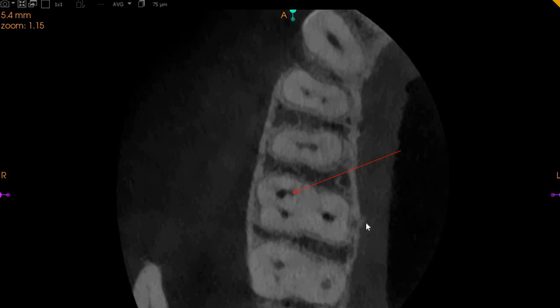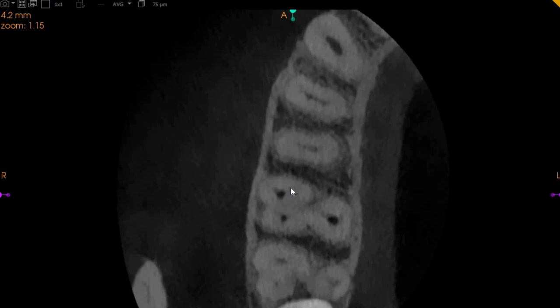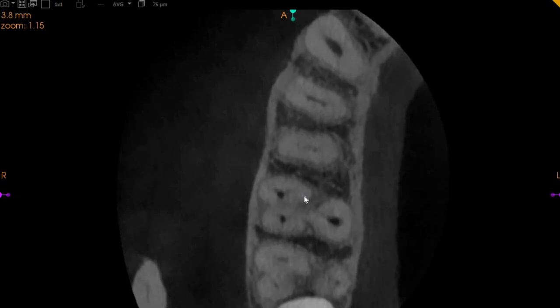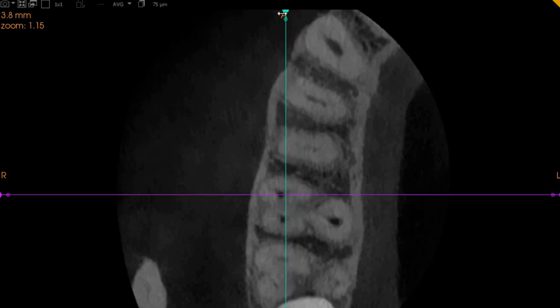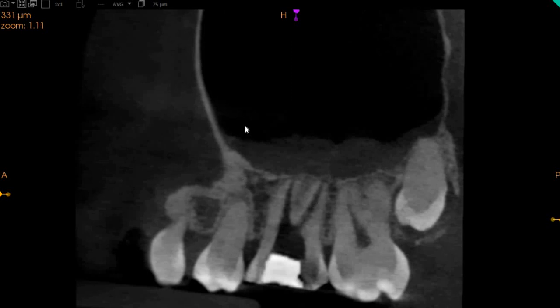As we move further down, this is the orifice of the MB2. As we move further down, the orifice becomes very sclerotic, but as you can see — this green line right here — this is where the canal morphology continues. This canal is not all the way through to the apex; it is stopping short of the apex of the tooth. Now we're going to move this green line to the MB1 and the distobuccal one, so this is the sagittal view.